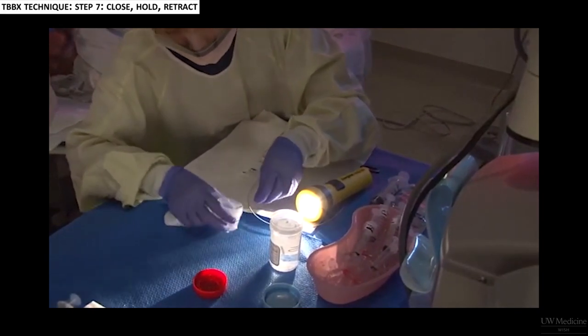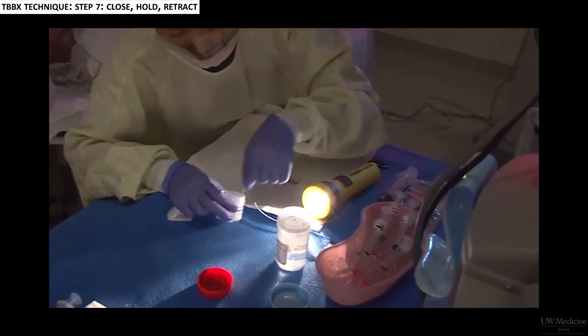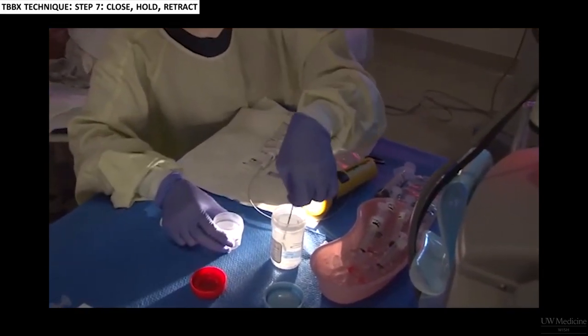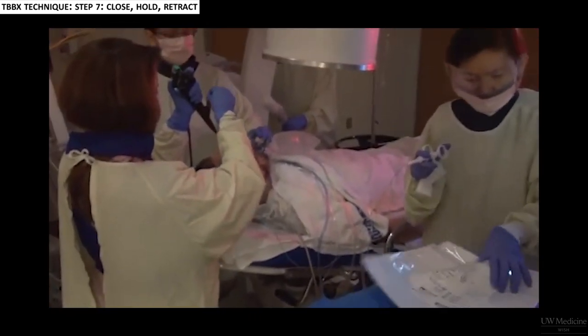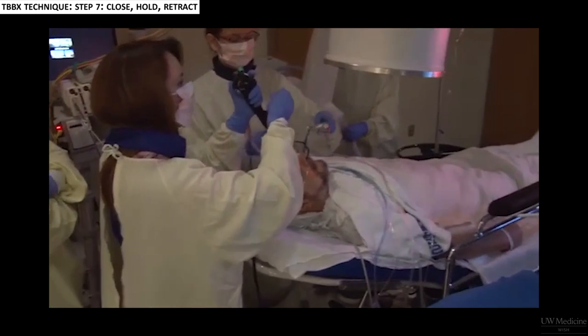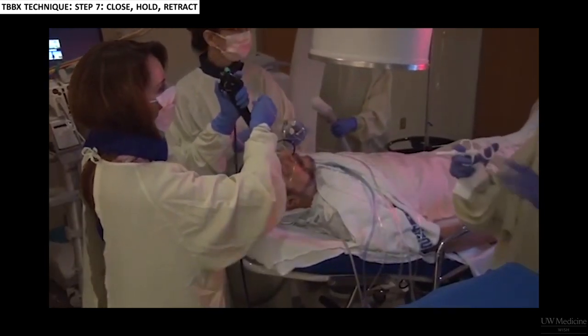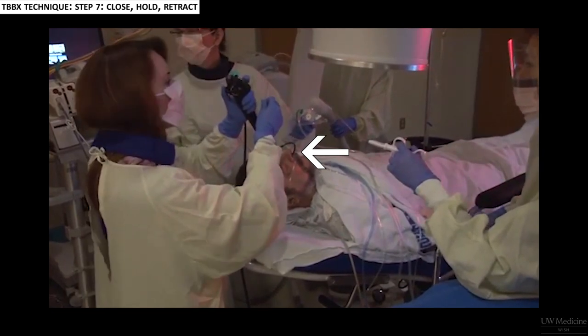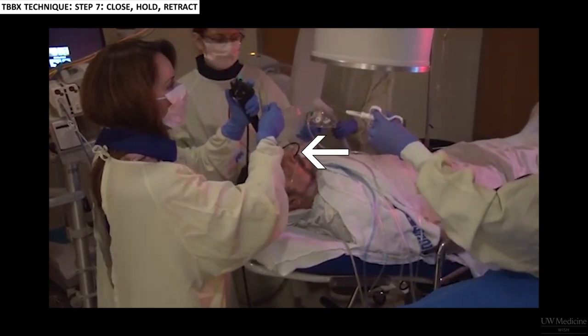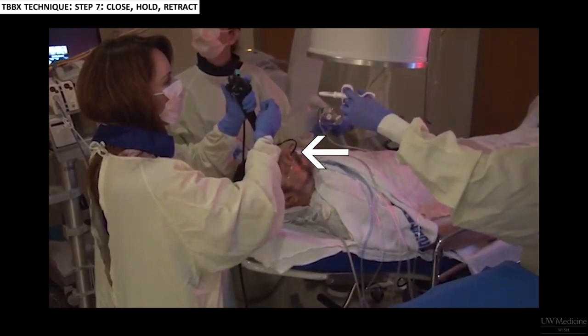The samples are transferred from the forceps into saline or formaldehyde solution. The forceps are then rinsed in saline before reinsertion. All this time, the bronchoscope is kept wedged in the airway of interest, and multiple samples can be taken without having to reposition. In order to stay in the wedged position, you often need to hold the bronchoscope at the patient's nose. You can ask a team member to do this for you if necessary.